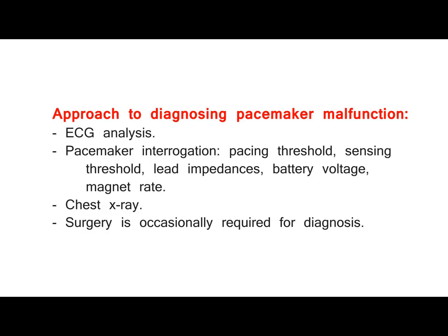Approach to diagnosing pacemaker malfunction: ECG analysis; pacemaker interrogation, including pacing threshold, sensing threshold, lead impedances, battery voltage, and magnet rate; and chest X-ray. Surgery is occasionally required for diagnosis.